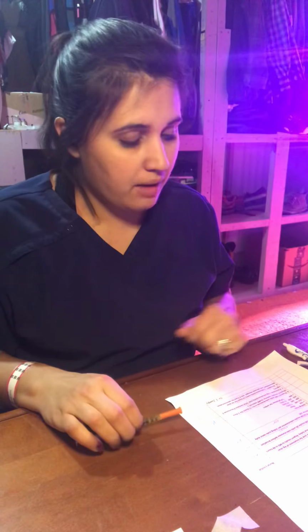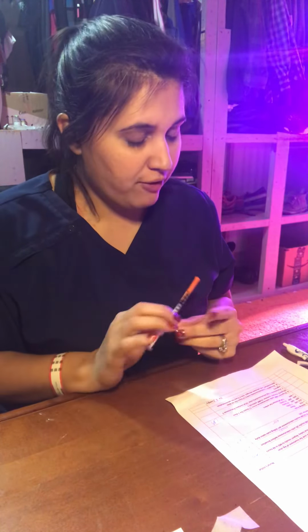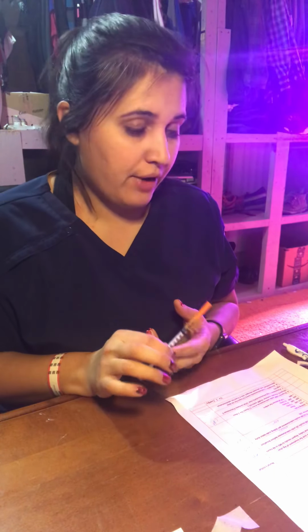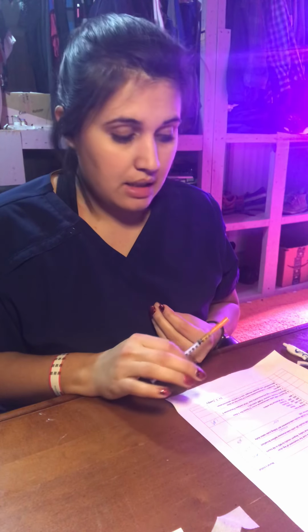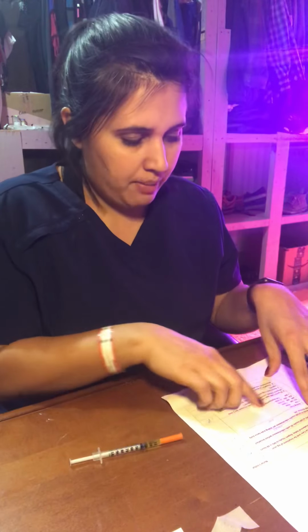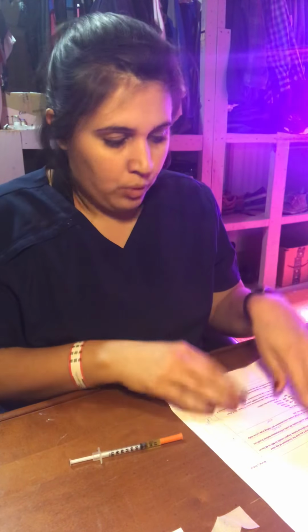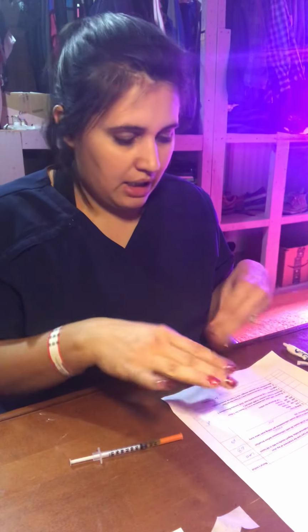Knock, knock. Hi, Mr. Sprocker. I have your insulin shot before breakfast. Can you please verify, tell me your first and last name and your date of birth, please? He says, I am Skip Rocker and I'm born January 1st, 1972. That matches my order. I go back into the MAR, make sure that yes, I am supposed to give this before breakfast. Look at his allergies. I'm looking at everything. Everything's good.